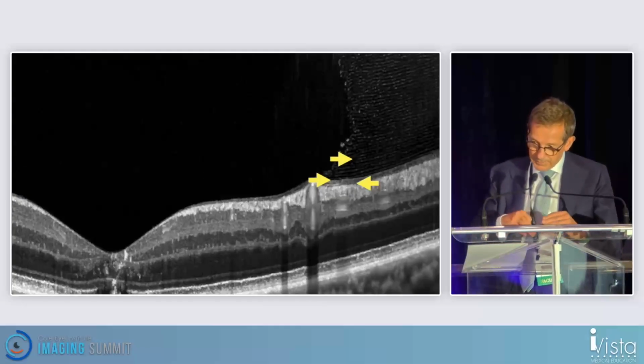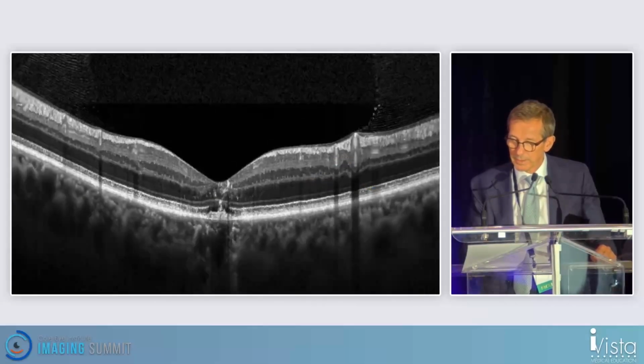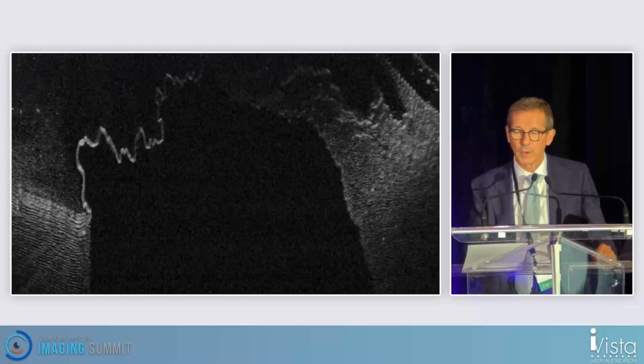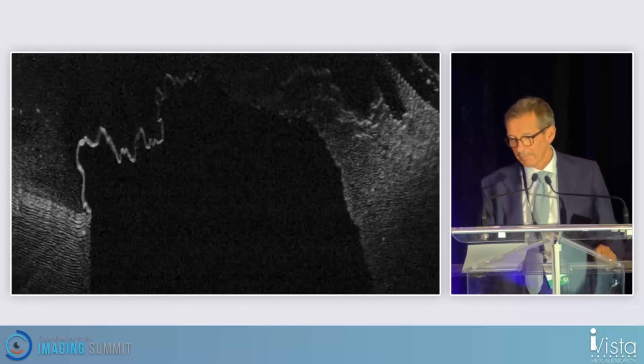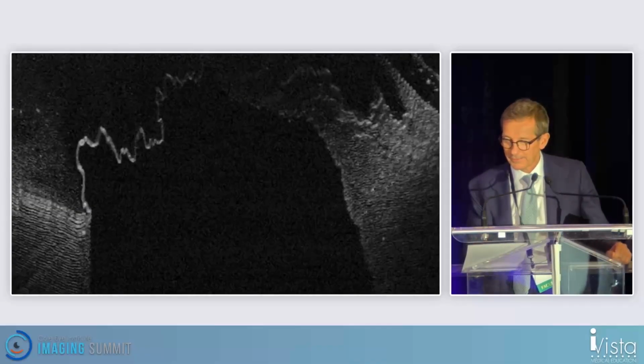If we move to the vitreous, you can see it quite well, something that we don't see so well.